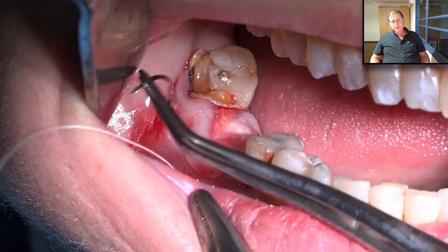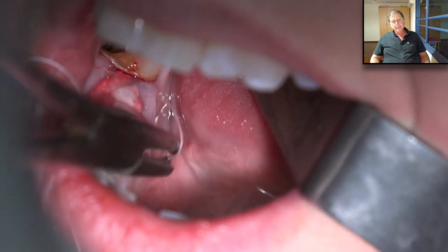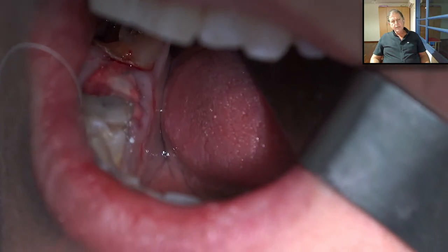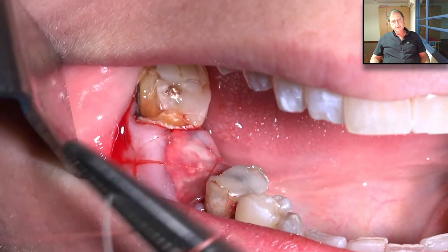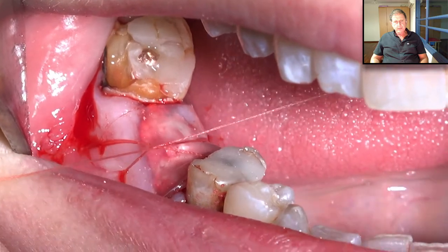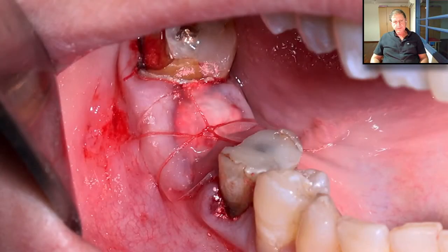We need to secure it in place. We take a suture and go from the mesial side to the distal underneath the Oraid band, then go to the lingual side from one side to the other and make a cross suturing. It's very important to suture the Oraid. Normally, if we use the Oraid without securing it by suture, after a few hours it has fallen off.